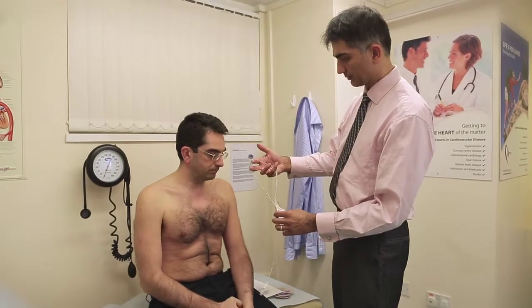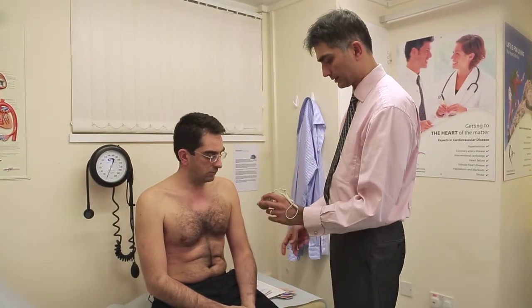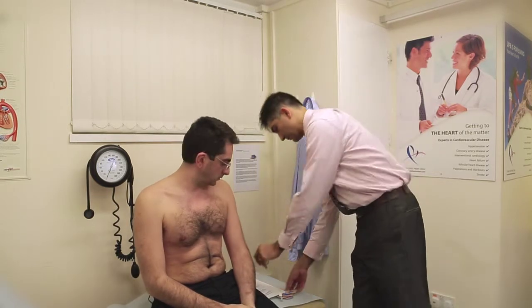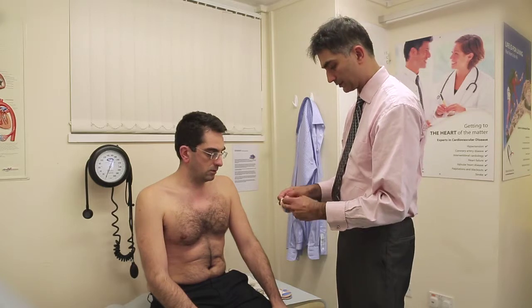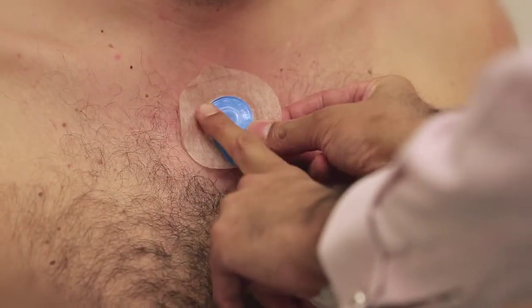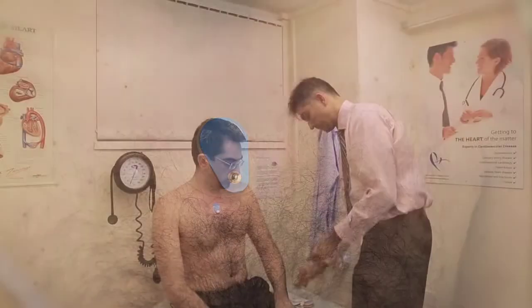An ambulatory ECG monitor is used for the diagnosis of palpitations or for the diagnosis of blackouts and dizzy spells. It's a small gadget that the patient wears under their clothes, and it makes a continuous recording of the patient's ECG for the duration that the monitor is attached.